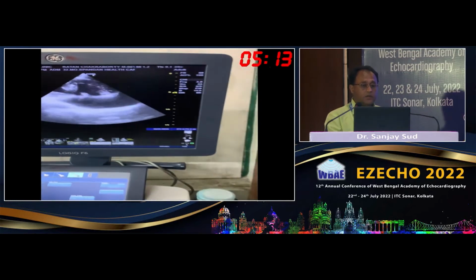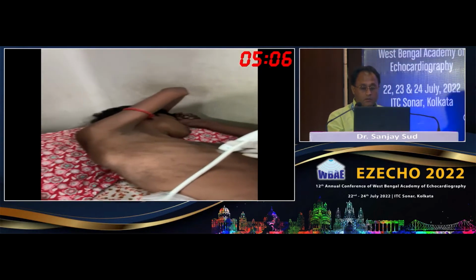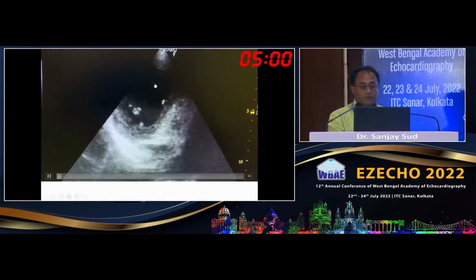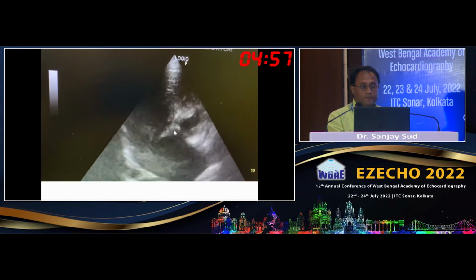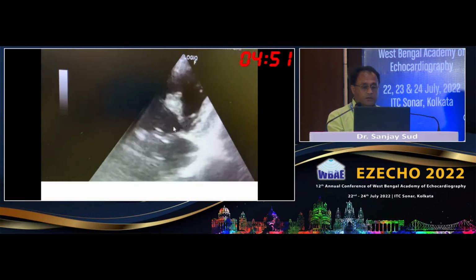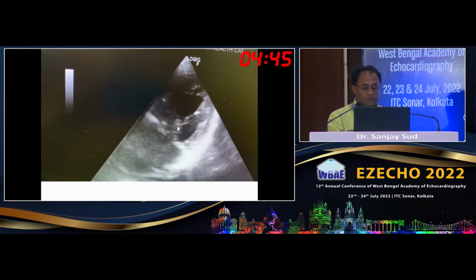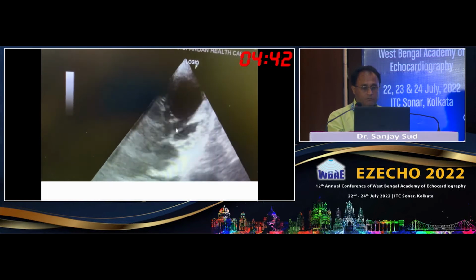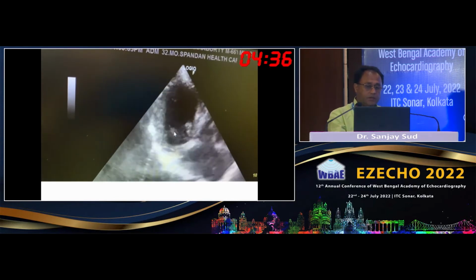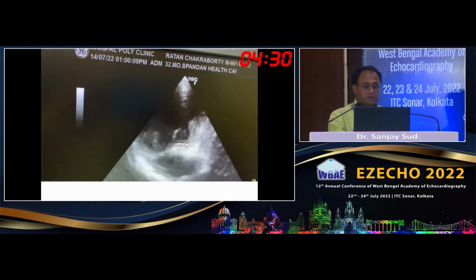As you can see here, the ventricular septal defect very clearly, and on the right hand side, the heart is. With the tachycardia and the difficulty in delineating, the images are not very clear, recorded from the screen itself, but a few interesting things can come up. Here you can see the left ventricle on the left and the right here, and the aorta.